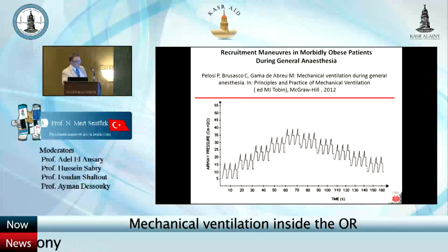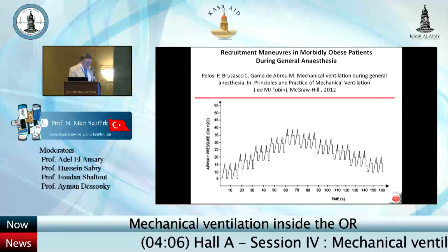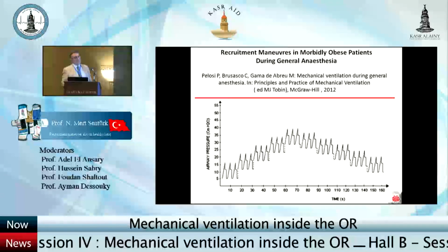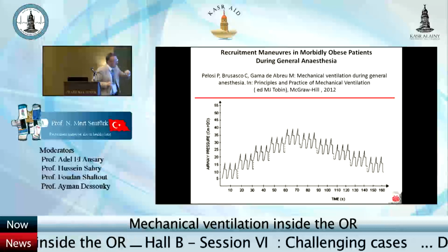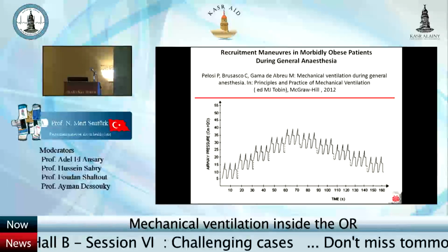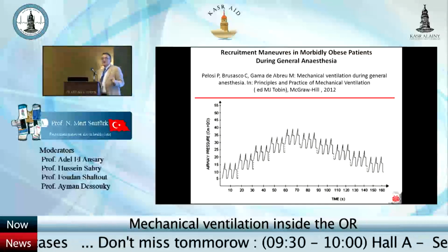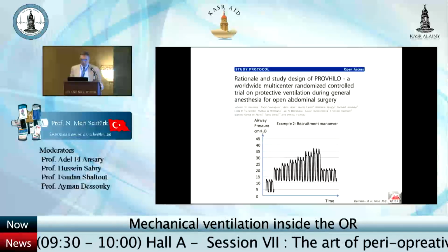The driving pressure is constant, as you can see, and we go up to 30 or 35 of PEEP, and your peak pressure or plateau pressure would be approximately 40 centimeters of water. At the peak here, somewhere here, you would have all your alveoli open. This is the most physiologic way of applying a recruitment maneuver.